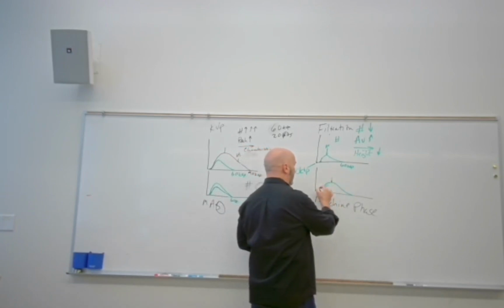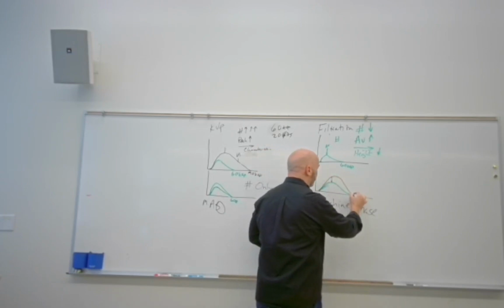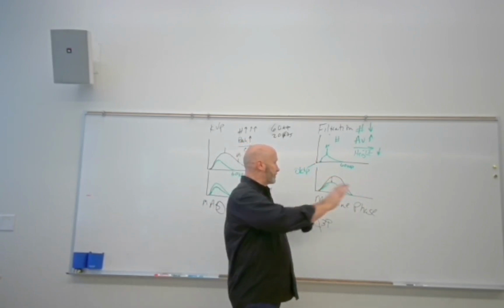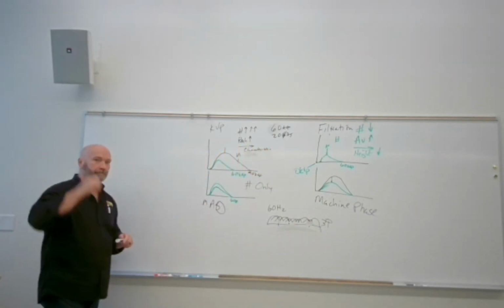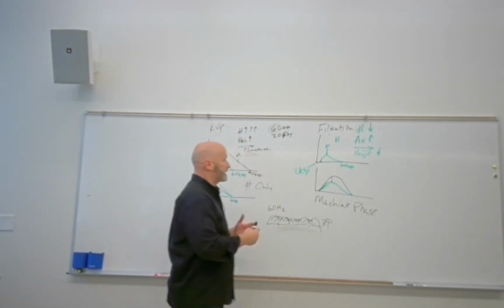Average, right? So what we're going to get is an increase in output. Peak energy doesn't change. We get an increase in output, it pushes towards the high energy side. Increase in numbers pushes towards the high energy side. Okay, where you're going to confuse these two is the similarities.